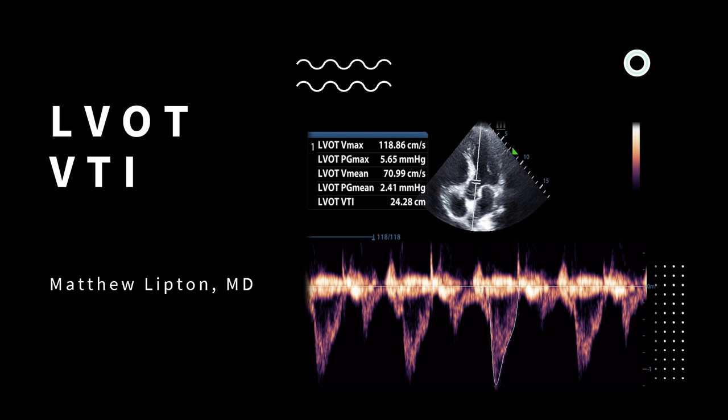For this month's critical care ultrasound video, we aren't going to discuss a case. Rather, I'm going to explain an echo topic that is very powerful but rarely utilized. It's called the LVOT VTI. I'll answer the following questions: What is the LVOT VTI, and how can it help me with the resuscitation of a critically ill patient?